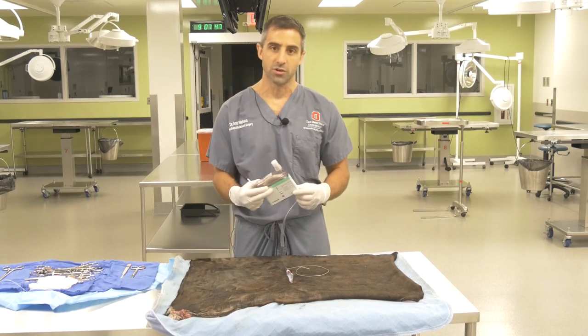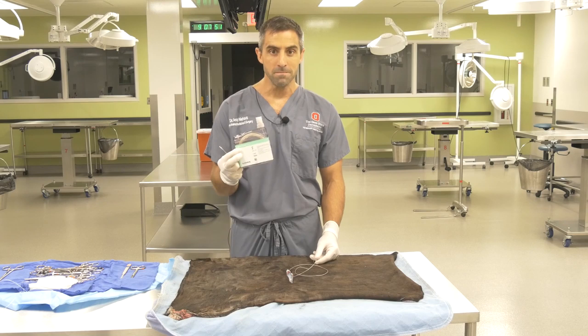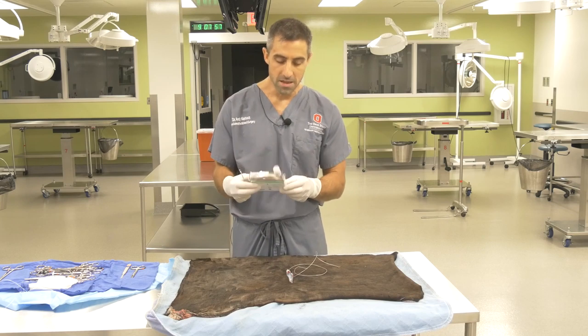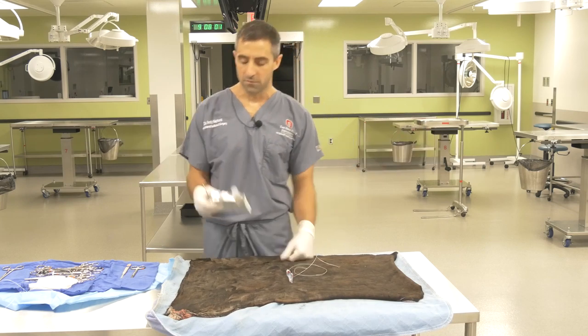Very commonly in suturing bovine skin, at least here at OSU, we use Bronimid. One of the nice things about Bronimid is it comes on a reel, so it's fairly inexpensive and we can custom make whatever length of suture we want.